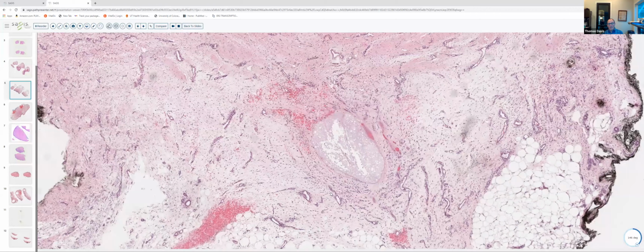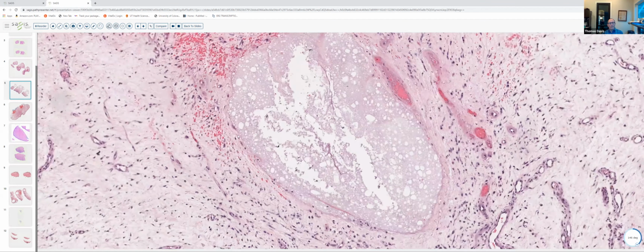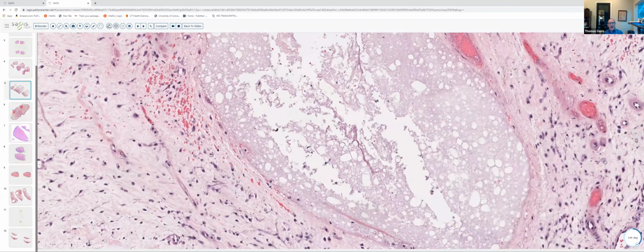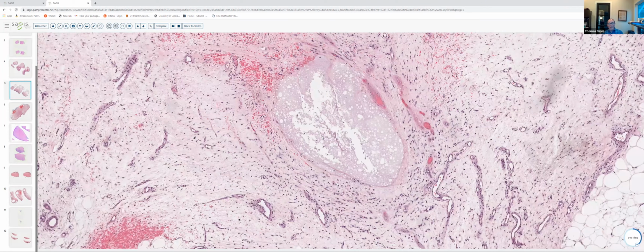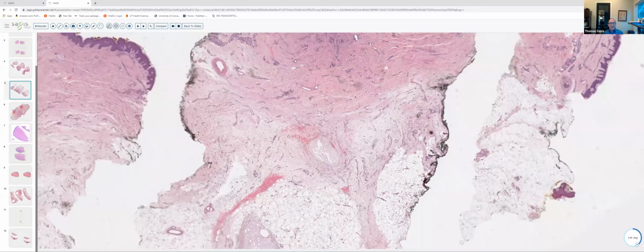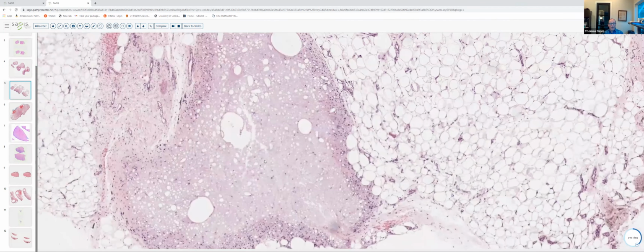We've got, and we covered this a few weeks ago, a pool of kind of bluish gray bubbly material in the dermis. And this is intralesional Kenalog. This is Kenalog that was injected. This must have been somewhat of a clinically hypertrophic scar, but not really histologically. Got another pool of triamcinolone down here in the dermis. So we had a little bit of a twofer here.